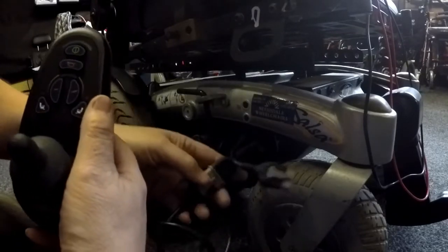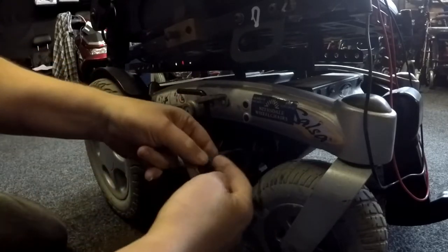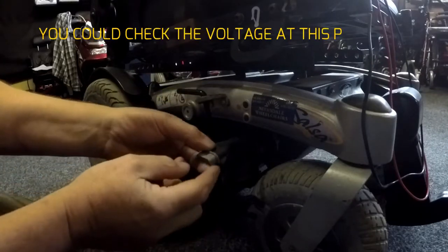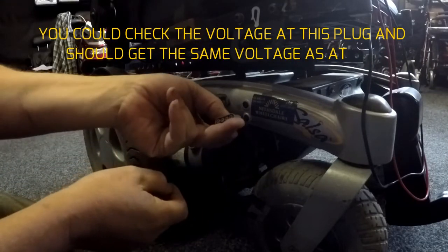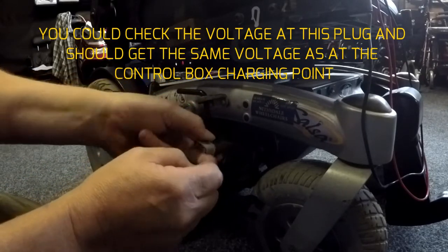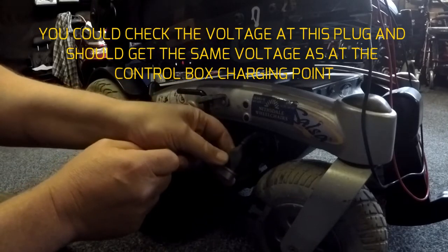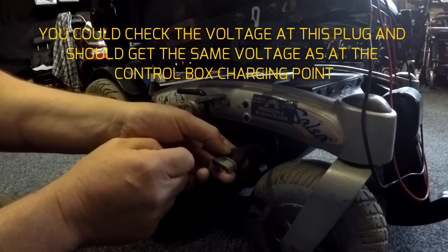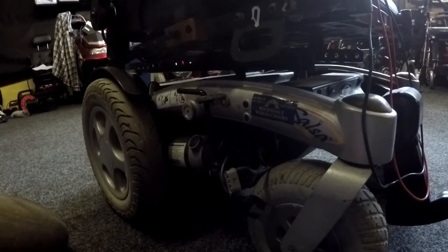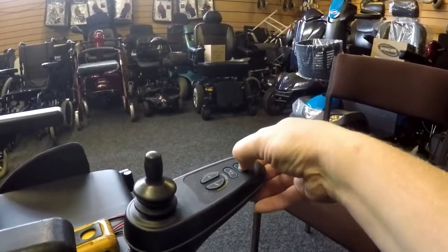Now, possibly it could be this small extension cable here that goes into the power module located at the front. So what I'm going to do is take the plastic panel off the front and try and see if there's power coming out there at the front of the panel, and we can try and replace the wee extension here, the VR2 extension. It could be because we're having problems with the joysticks themselves here, constantly sticking on. It may have done damage.